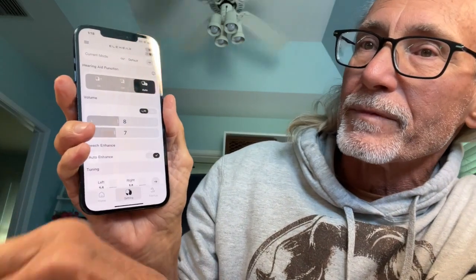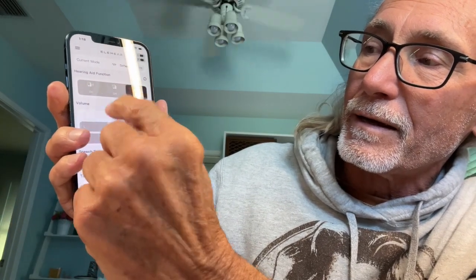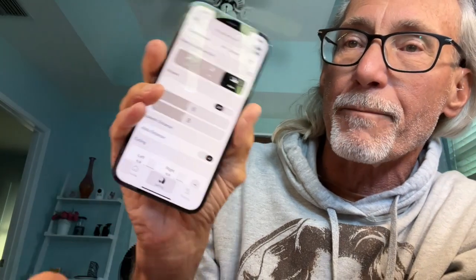Oh, I can hear it, too, as I do it. So look, I can change the volume here. So that was my left ear. I just turned it up to 7. Here's my right ear. I'm going to go to 8. So you can change them independently of each other on the app, all right?